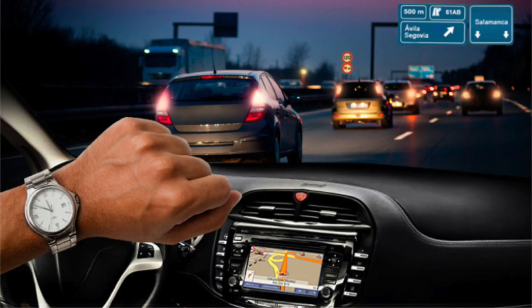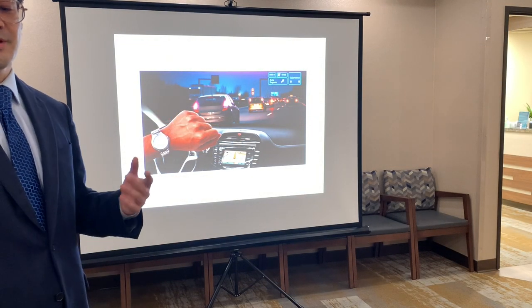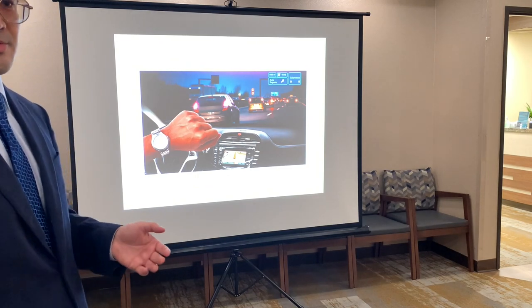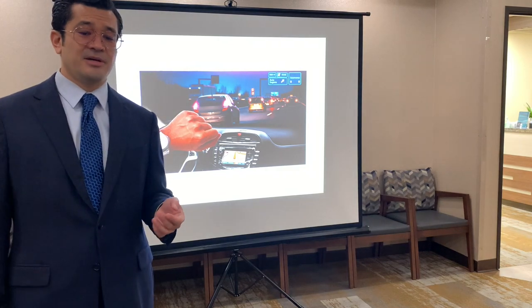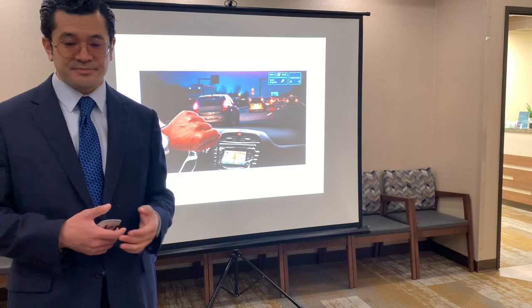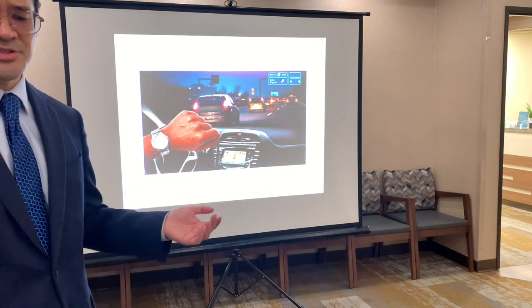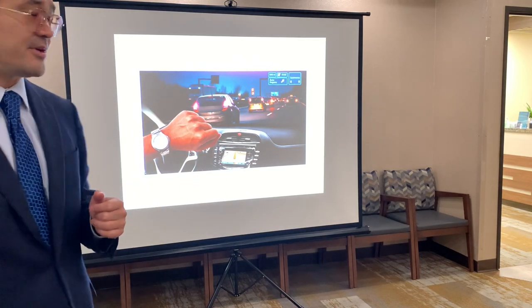So this is an interesting one. This is nighttime. So I put this on here because when it's nighttime vision, some of the lenses that are multifocal aren't going to perform as well. So you also want to keep that in mind when you're talking to people. Hey, you can see your, well, maybe not so good at nighttime. If you're a truck driver that does a lot of night trips, this might not be a good situation for you.